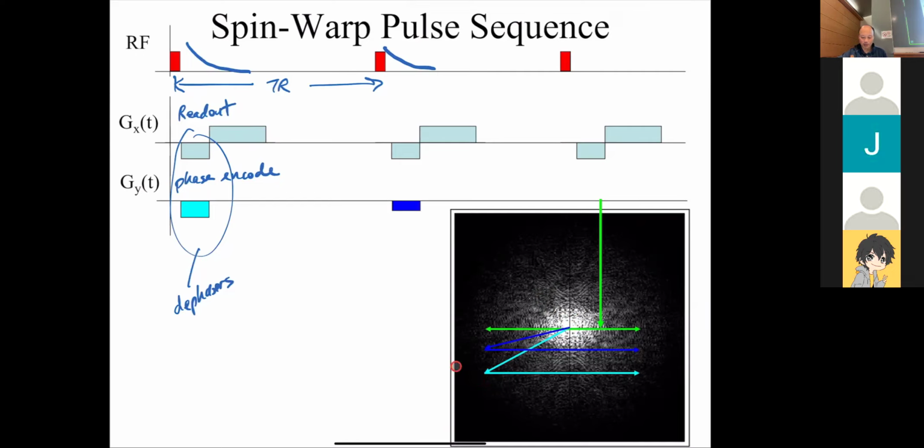Okay. You want to zoom out here and collect data. So you want to run as fast as you can to the starting point and then you collect the data, and you run to another starting point and collect the data.